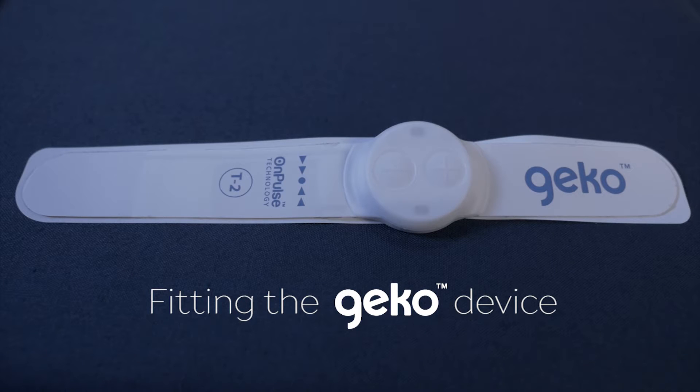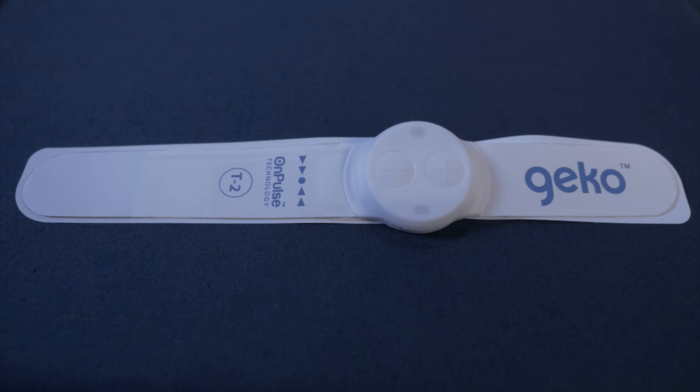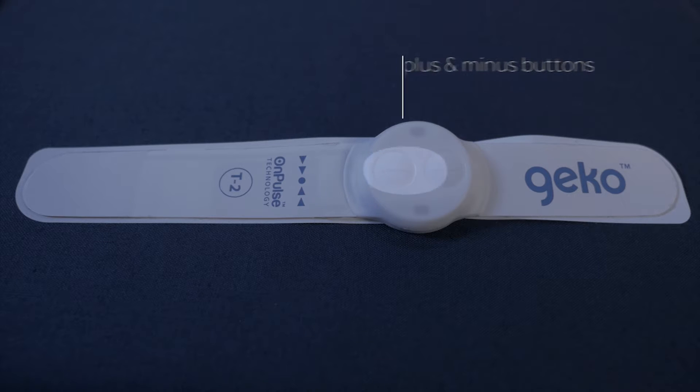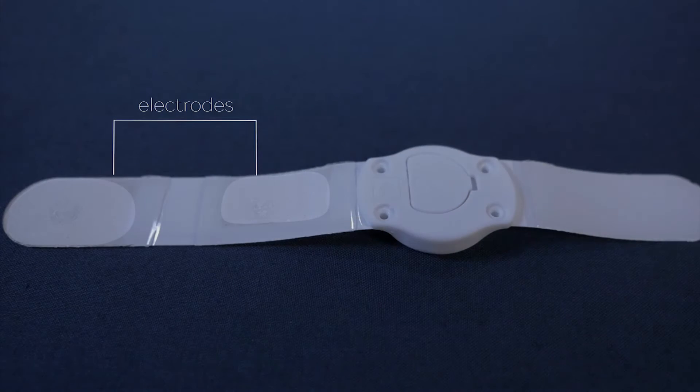The GECKO device is easy to fit and can be applied in just 60 seconds to one or both legs. On the front is a location marker — the line of arrows — to correctly position the device. Plus and minus buttons to switch the device on and off and to change stimulation levels. Two indicator lights. On the reverse are two electrodes that make contact with the skin.